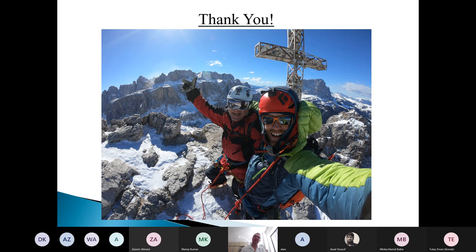that every new installation will automatically get this inverse planning, because especially in new centers, I think it can save a lot of trouble. Yeah, when you have staff who are not capable of good planning, this can help. As soon as you contour the target volume and critical structures properly, it can really do an amazing job for you and can do it very quickly. So that's our suggestion, but of course we are not business people. When traveling with my colleague for system startups, we told Elekta, but it could be a regional decision of the sales managers, of course.